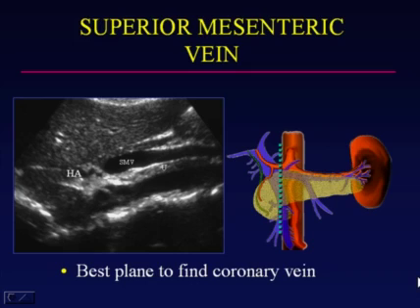So here is an example where we have turned 90 degrees to the splenic vein in the portal confluence, and you can see this elongates the superior mesenteric vein where it runs over the inferior vena cava, and note you can see that uncinate process interposed between the superior mesenteric vein and the inferior vena cava.